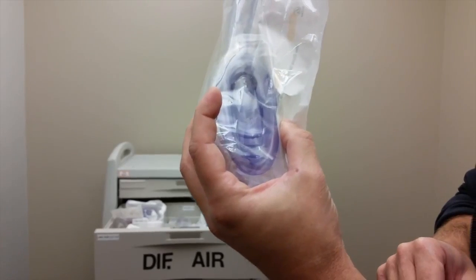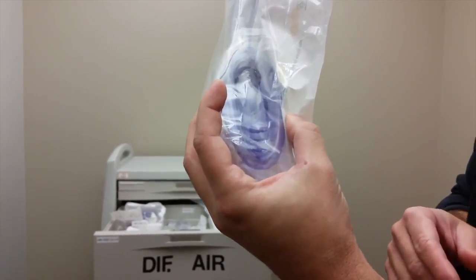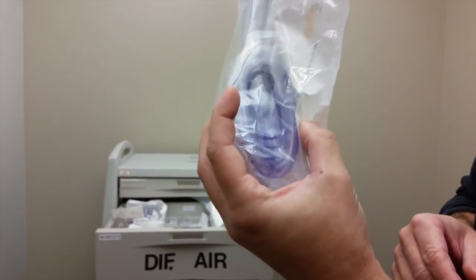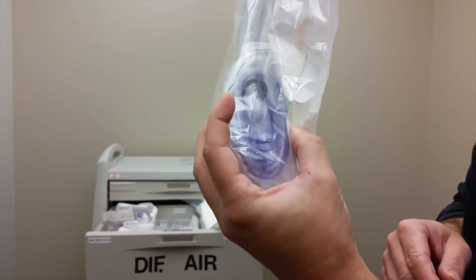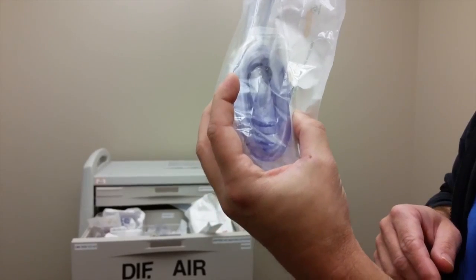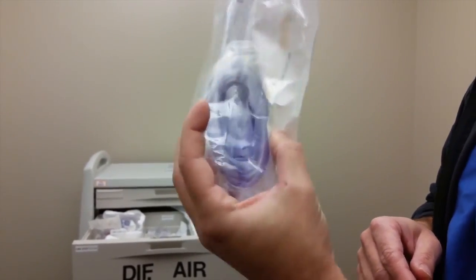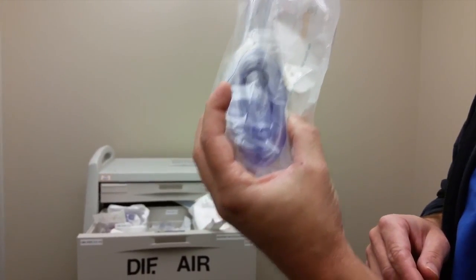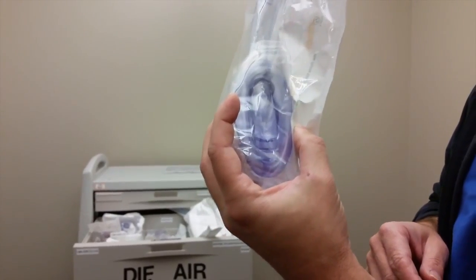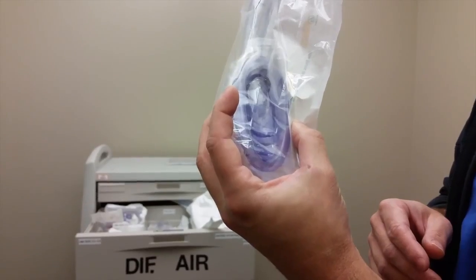Remember, this actually is a supraglottic airway, meaning that it sits above the glottis. It doesn't go into the trachea, and so it's not technically a secure airway because, well, vomit could still leak around it. You can't get a tight seal. You wouldn't be able to provide high levels of airway pressures or high PEEP for a hypoxic patient, etc. So this is still kind of a temporizing thing, but it definitely would serve the same purposes as a bag mask ventilation, and also easier to do it because you don't have to have a tight seal on the face, and it's a good rescue method if you're having trouble getting a tight seal for various reasons, be it a beard or somebody has a small face or whatever the case may be.